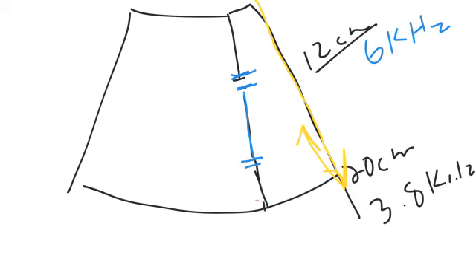Now, this works if you have your one vessel down here at the depth you're trying to image at. It won't work if you have two vessels, one at each sample volume. If you have this situation, you have to go find another window so that the second vessel is not in one of the sample volumes. So the only one you're interested in is down here. Make sure that's where you want it, and make sure that your windows are such that you don't have another vessel in your sample volumes.